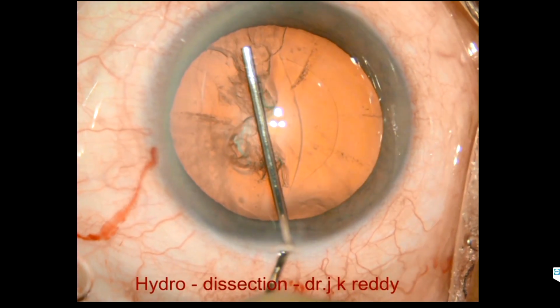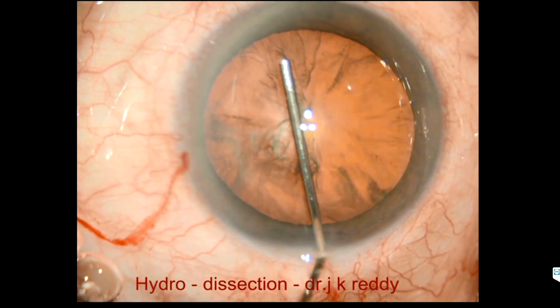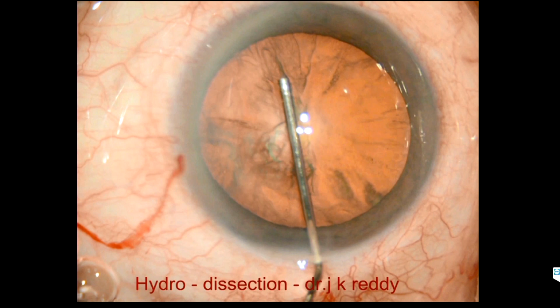Hydrodissection is the point where cortex aspiration management starts. Once the wave goes, I will stop it. I don't do delineation, a golden ring. Indians like gold, so they want to keep on getting the gold, they want to see the gold. So you are left with epinucleus, which is very troublesome to manage if you create the golden ring.